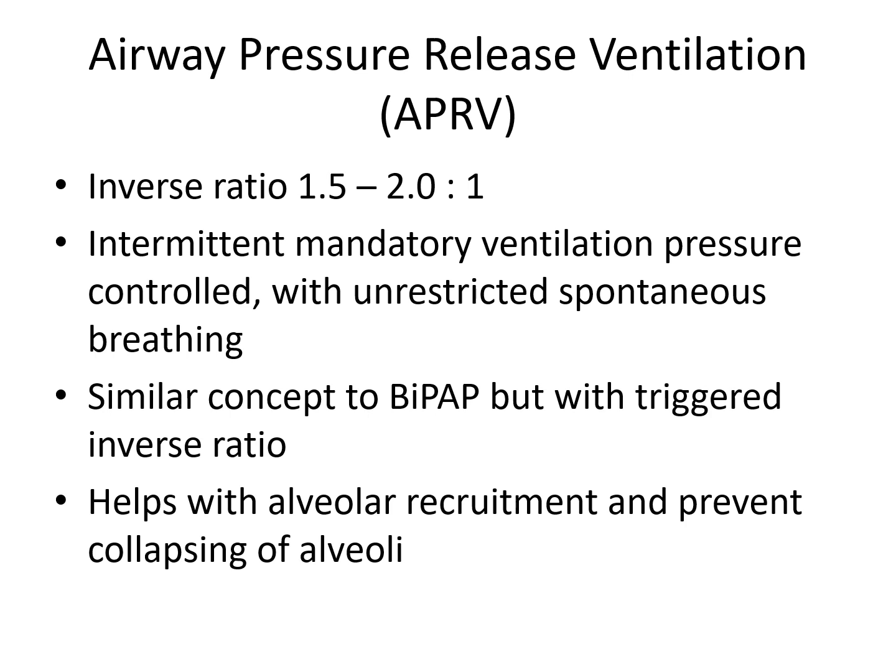Airway pressure release ventilation, they call this APRV. Patients tend to be more comfortable with this setting because they have unlimited spontaneous breathing ability and have less effect on the cardiovascular system because there is less positive pressure pushed into their airway. Regular spontaneous breathing maintains diaphragmatic muscle conditioning, so this is good for those patients to maintain their diaphragm. Patients have the ability to maintain their spontaneous tidal volumes with unrestricted flow patterns. And the longer the inflation time, the greater the lung areas potentially available for gas exchange.